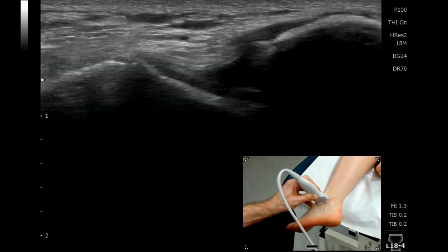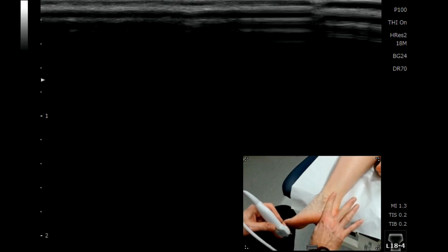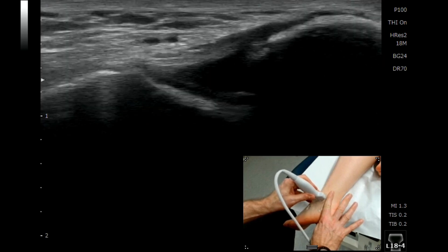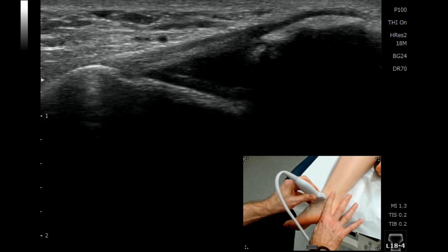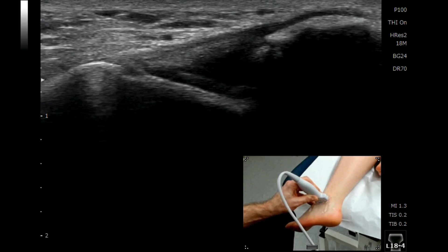So going through again how we find this structure: place your finger aligned with the back of the lateral malleoli, place your probe exactly butting against the finger, and we see a really nice image of the anterior talofibular ligament with the probe exactly parallel with the sole of the foot.